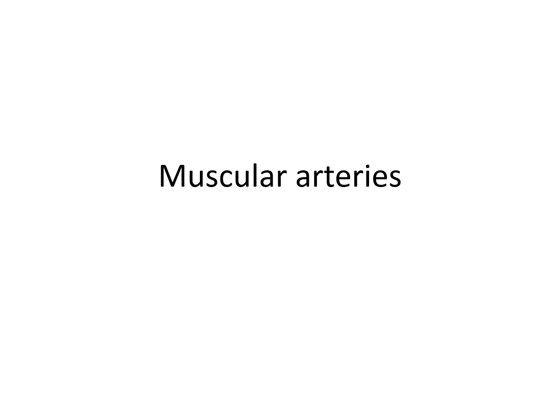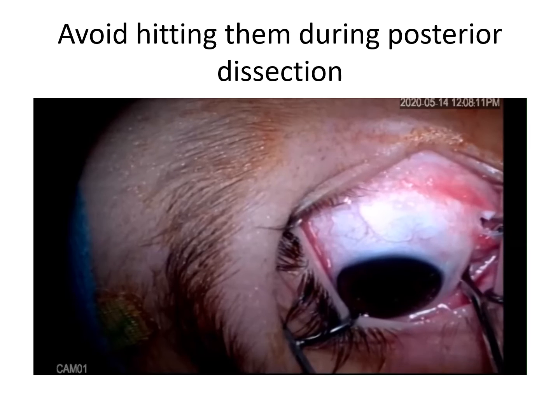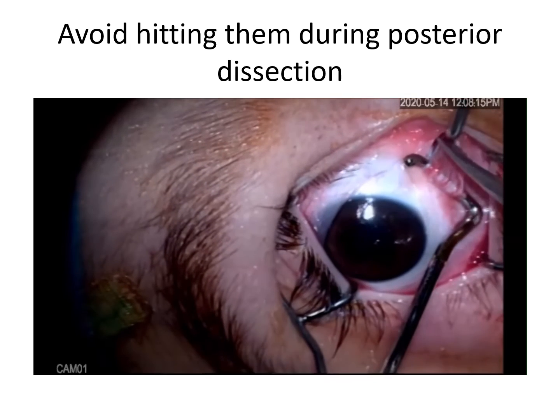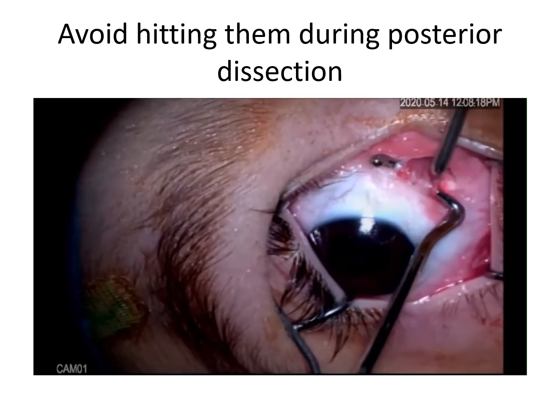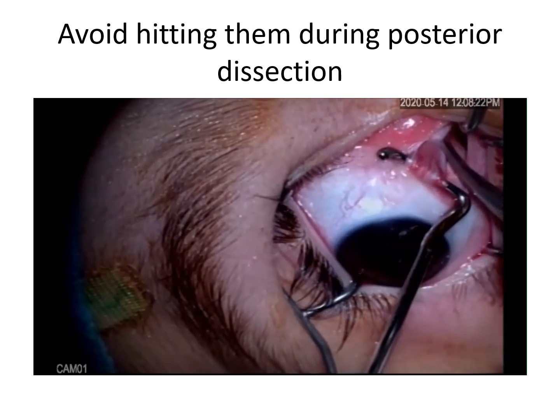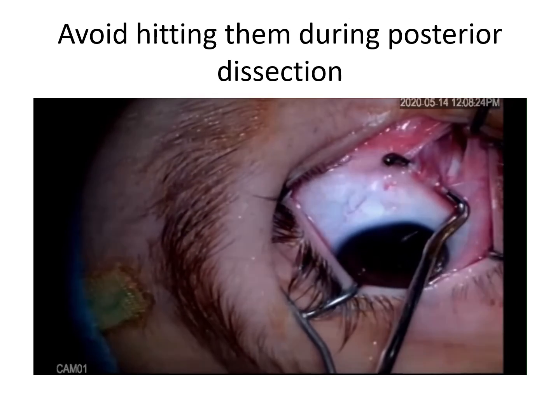Another source of bleeding is the muscular arteries. These vessels might be accidentally cut during excision of the intermuscular septa, so you have to observe them clearly while doing this dissection.